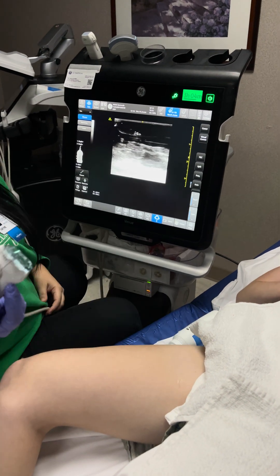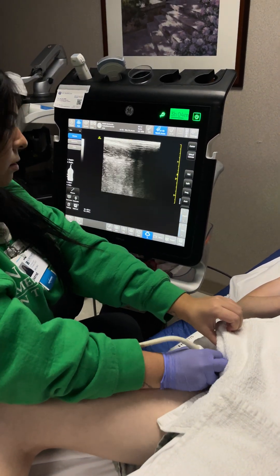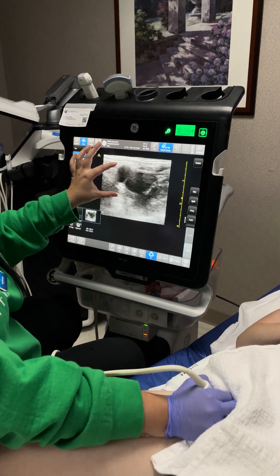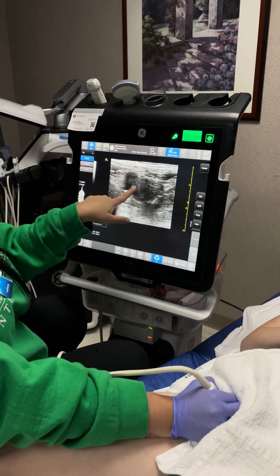We're going to start up high in the groin. We're going to look at her common femoral, and here we have it — we have vein and artery.